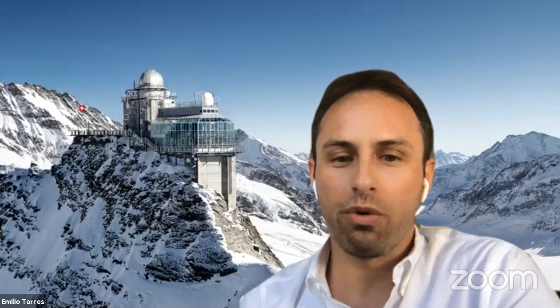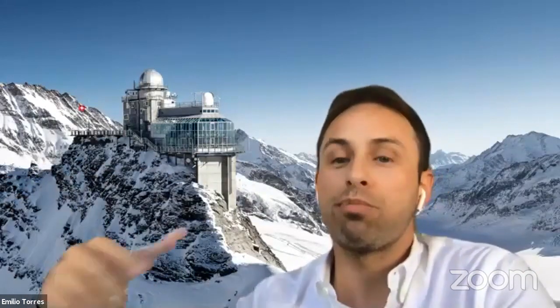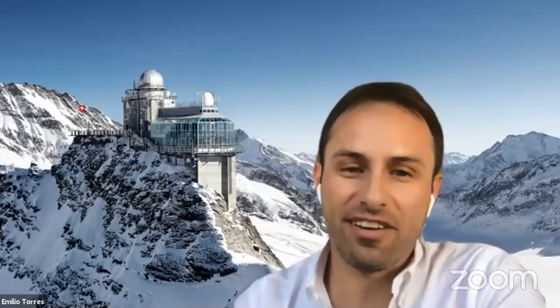With the epithelial map, I'm not saying this is true, because we are just learning from this right now, but imagine that the cornea is changing. Some colleagues are already trying to evaluate if these changes would be reflected in the epithelium. I mean, if the epithelium is completely normal, probably this would tell us that the disease is not progressing. But as I said, this is just a hypothesis and we need to prove it in the future. But at least we have hope that someday we can have a tool, or we have it already, who knows, to tell if a cornea is progressive or not based on only one assessment.